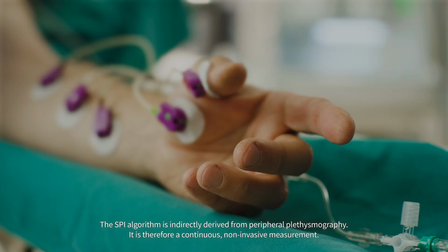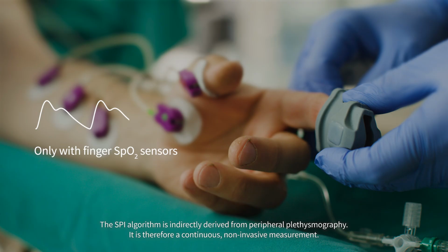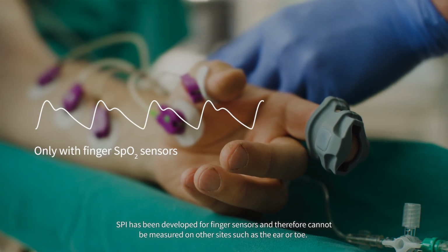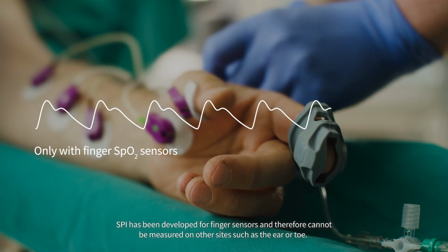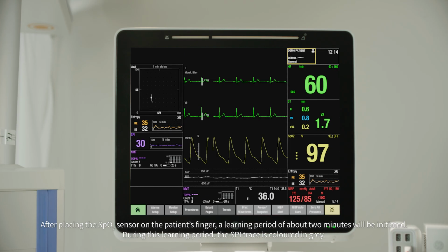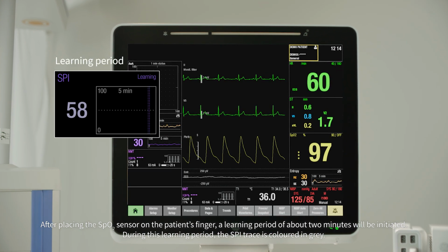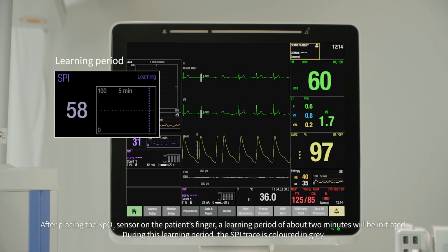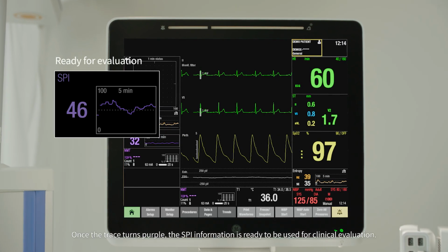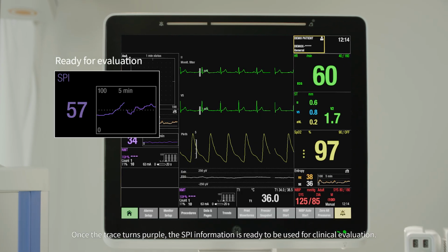The SPI algorithm is indirectly derived from peripheral plethysmography. It is therefore a continuous, non-invasive measurement. SPI has been developed for finger sensors and therefore cannot be measured on other sites such as the ear or toe. After placing the SpO2 sensor on the patient's finger, a learning period of about 2 minutes will be initiated. During this learning period, the SPI trace is colored in gray. Once the trace turns purple, the SPI information is ready to be used for clinical evaluation.